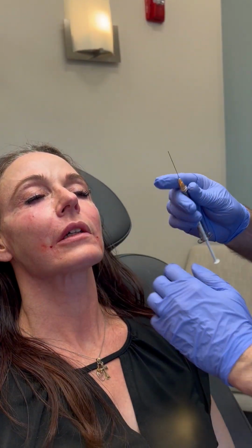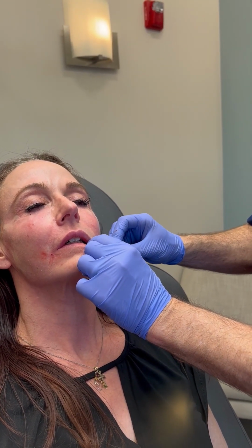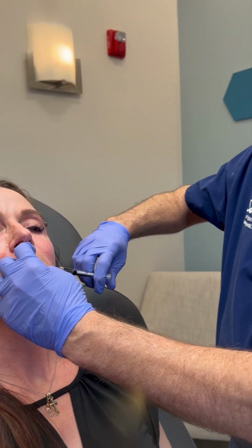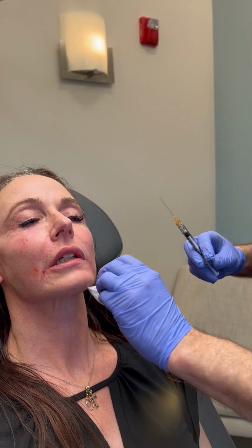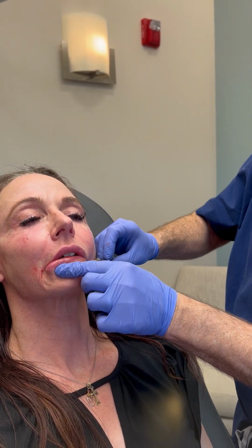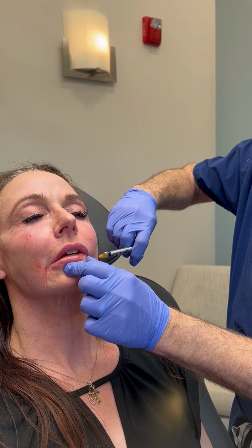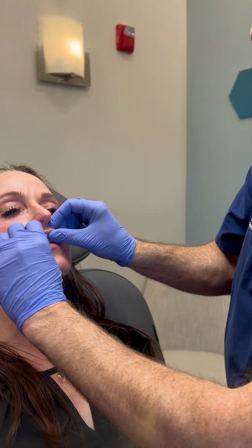And I often give the patient an opportunity to see if half is enough. We often split the syringe into 2 separate treatment sessions so that we don't overdo it. So we know the product will go down, but it can look overdone initially. And so we've got our 4 quadrants done there. And again, we just put it right down the middle. I think that looks pretty good.